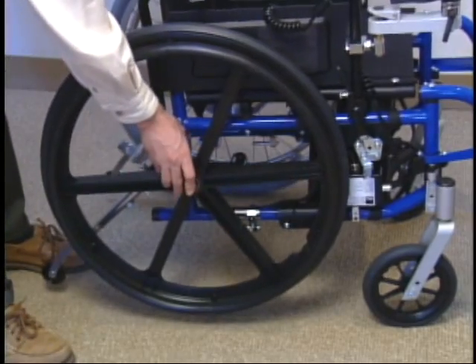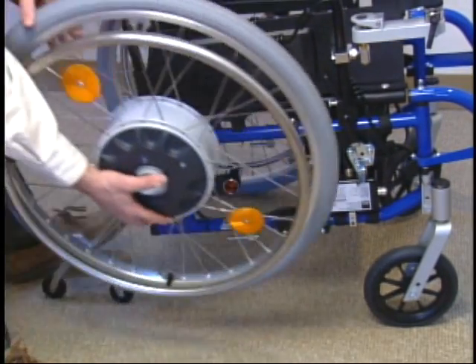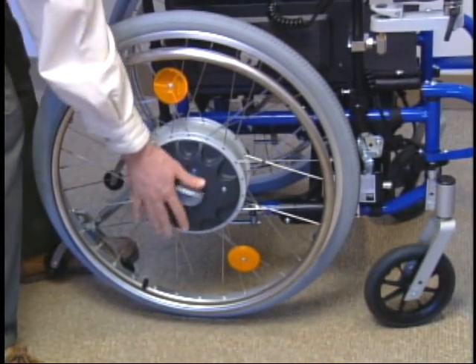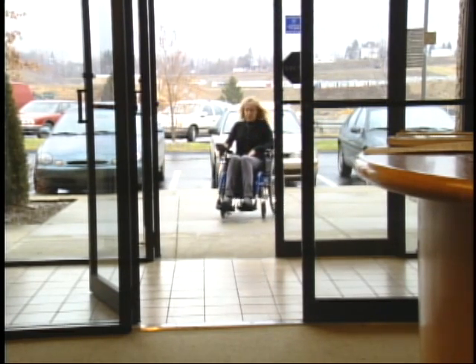This feature allows the user to still use the original manual wheels after the conversion, if necessary. Simply reverse the process to add the wheels back to the wheelchair. Now the E-Fix is ready to drive.